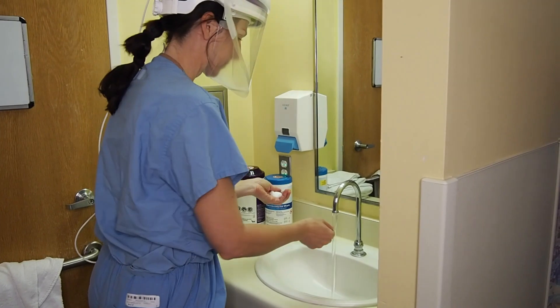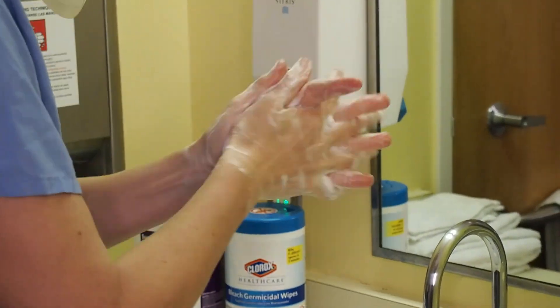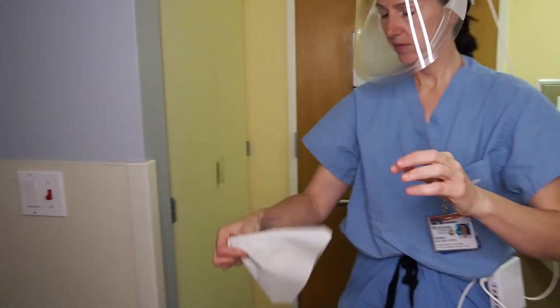Immediately proceed to the closest sink for vigorous hand washing of at least 20 to 25 seconds. When you're ready to leave, use a paper towel to open the door.